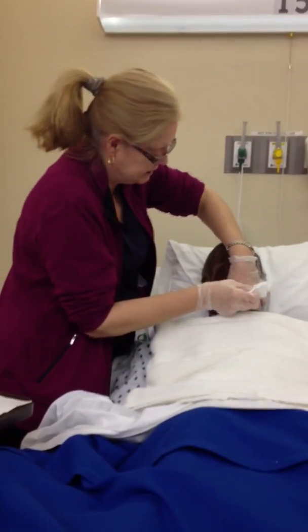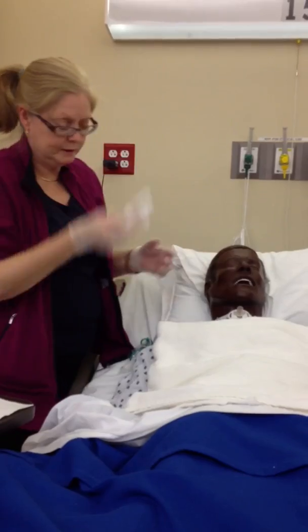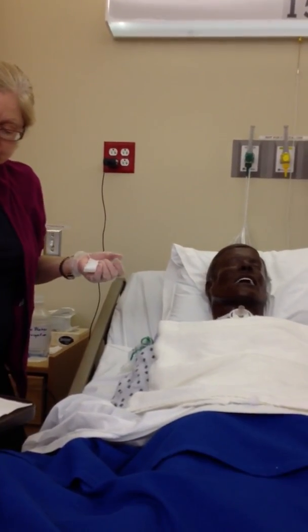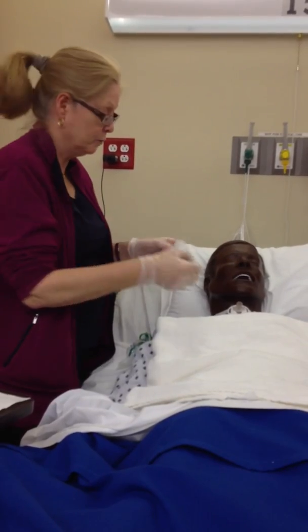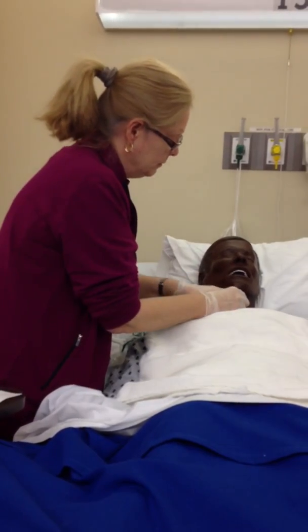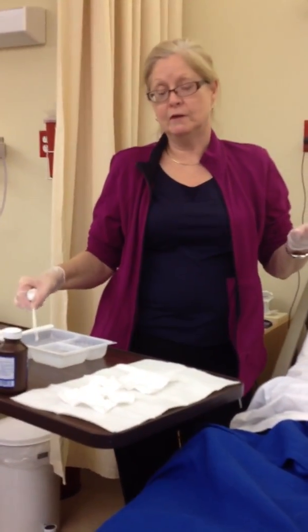You gotta dry it. Y'all done dishes before. So same thing, we're gonna just come under here, one direction, one swipe, and we actually have an extra, so we could use this one, but if you don't, you just flip it around. Same thing here, one direction, one swipe. And in reality, these little sticks don't do a whole lot for you. You really probably will need some extra 4x4s. So we got that done.